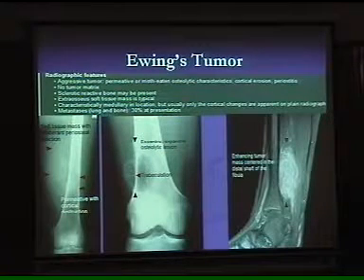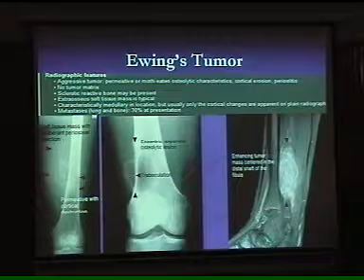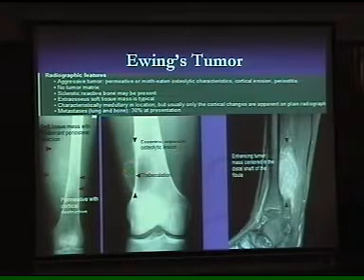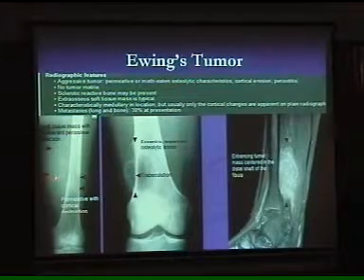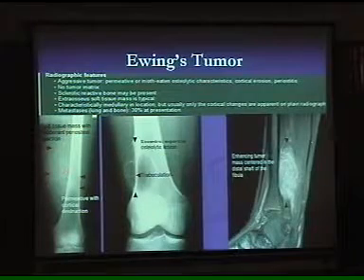and the formation of the growth. In cases of osteomyelitis, there is formation of sequestrum, but in cases of Ewing sarcoma, you don't find this pathology. What are the possibilities here? Look at this lytic area over there. This is eccentric, and it is involving the cortex. If you look at this, multiple soft tissue, cortical calcifications or new bone formation, you can appreciate over here.